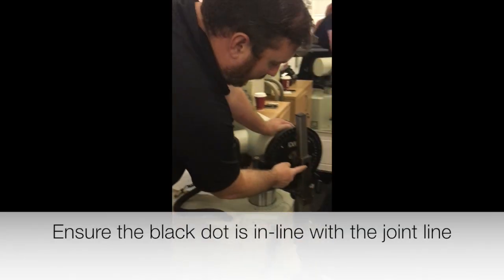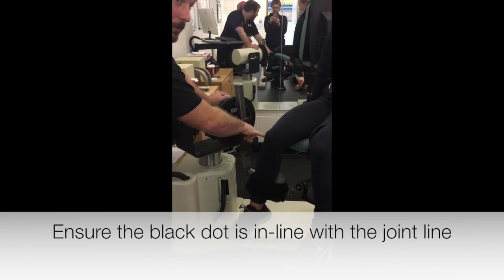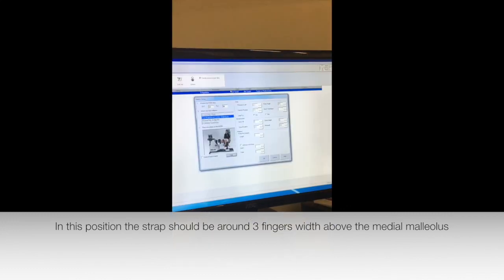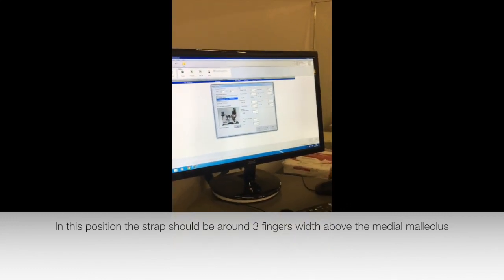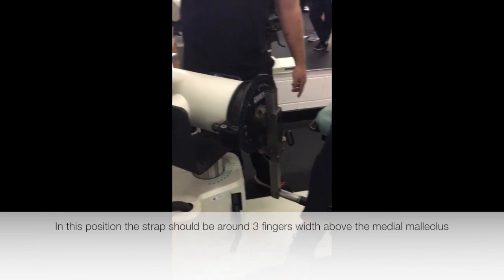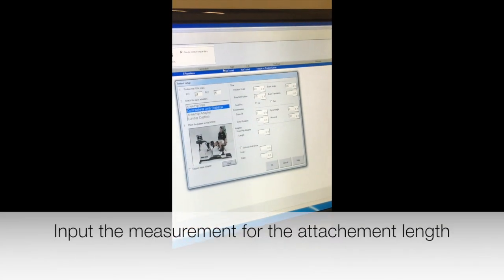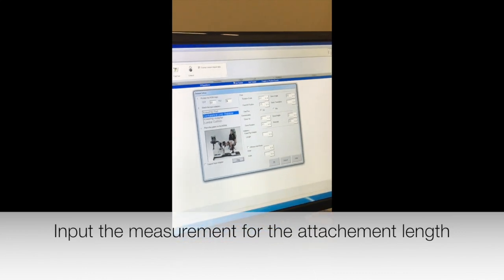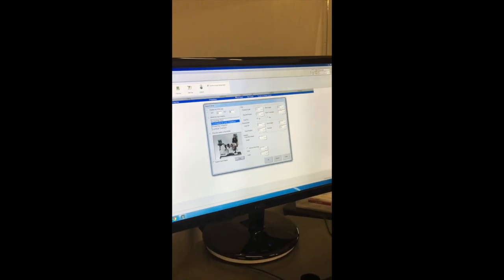In general, try and line that black dot up with the centre of the joint, roughly. Okay. What you can do as well is there's a measurement on the hip and knee adapter, like a ruler, which we can set, and you can type that figure in there. And this will be the same for the hip, this will be the same for the shoulder. You can type all these figures in, and it'll remember it for the next time. And then don't worry about this Johnson anti-shear. Don't worry about that.